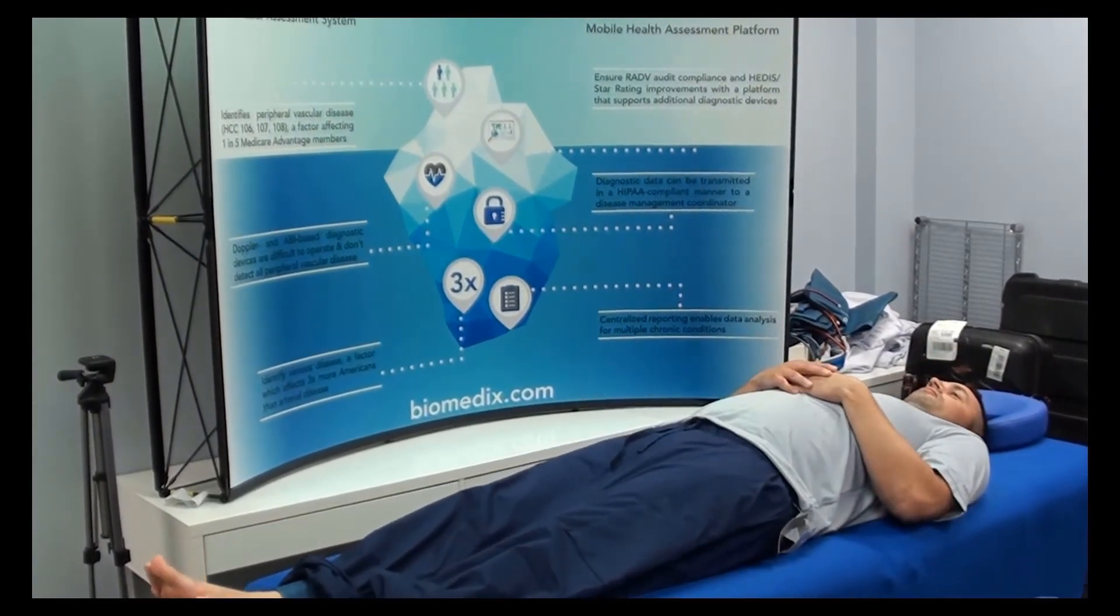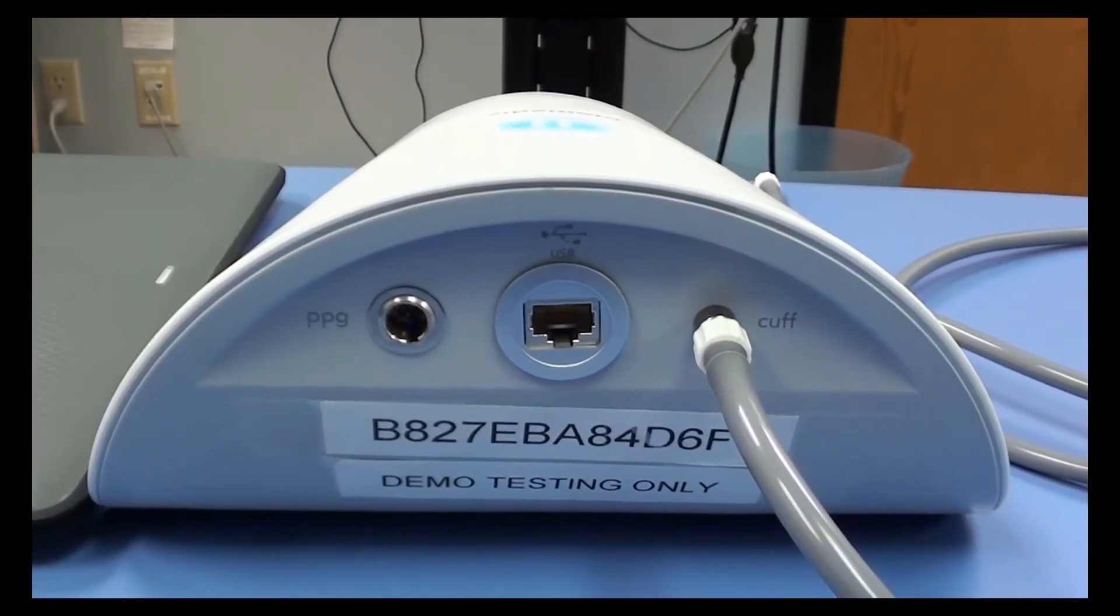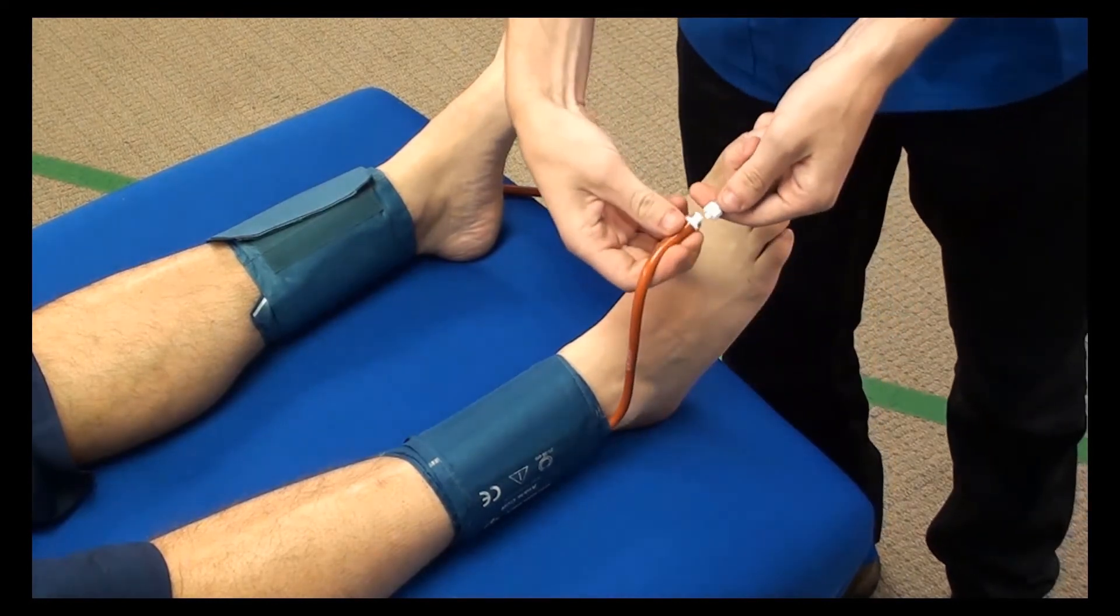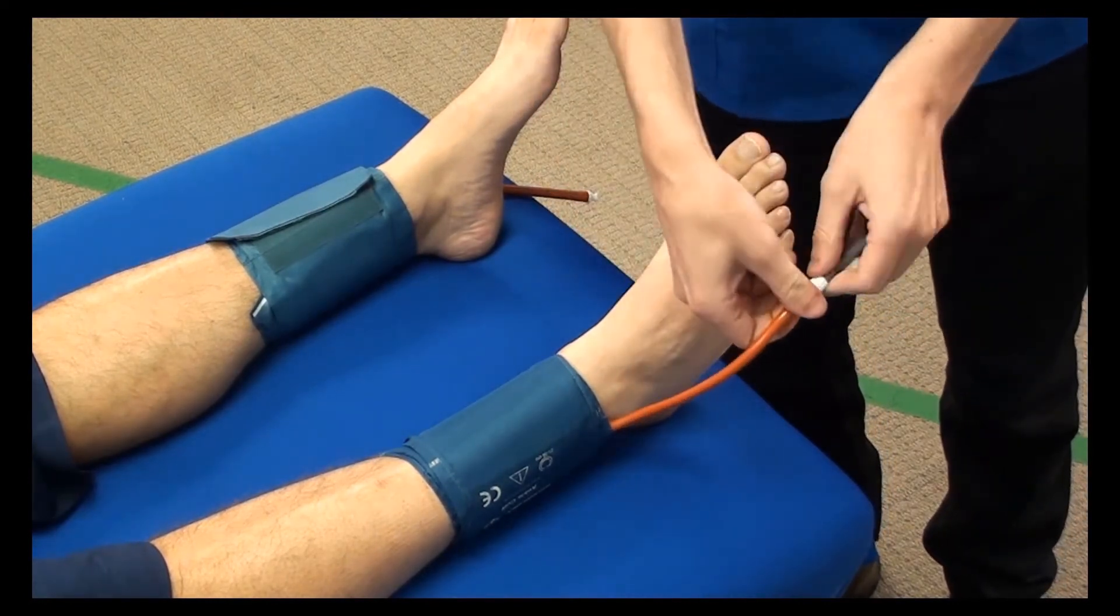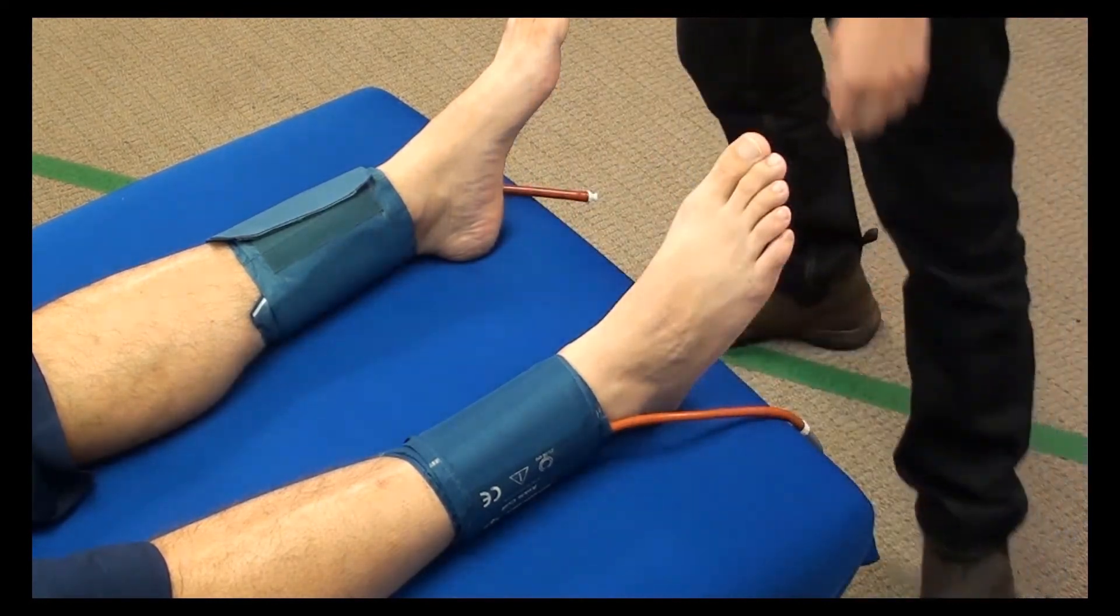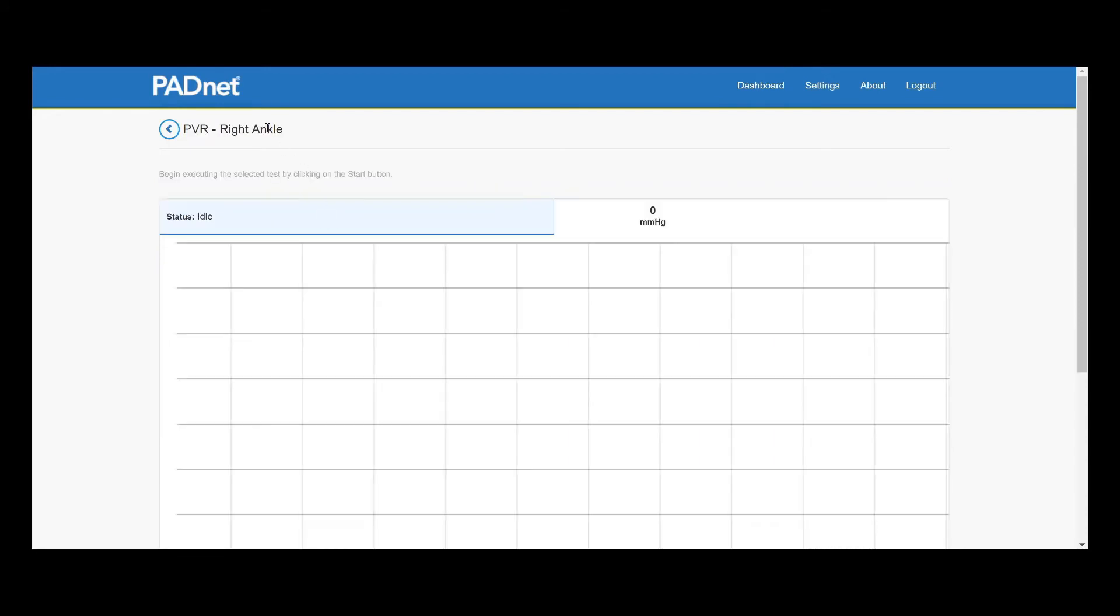Once the patient has done their reps, we want to put them in a reclined state and using the gray hose, we're going to hook them up to the right ankle cuff. Once our patient is hooked up to the cuff, we want to begin our PVR studies right away.